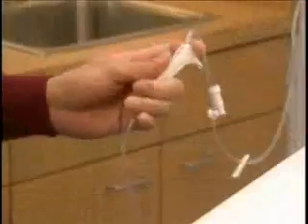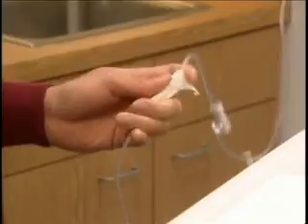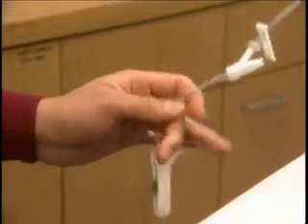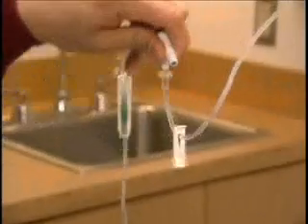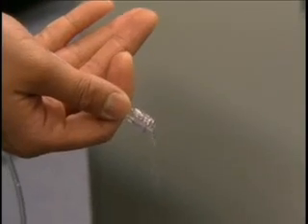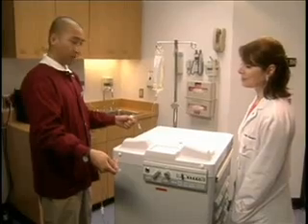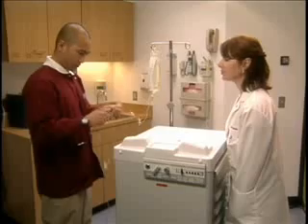There we go. Now I release the clamp on the tubing, allowing the fluid to move through the tubing. And as the fluid moves through the tubing, as it reaches the Y ports, invert the tubing to fill the port. You should do this for each port on the tubing. There you go. Now this is called priming the tubing. That's right. It's done to remove air from the tubing. Now close the clamp and check to make sure no air bubbles remain.